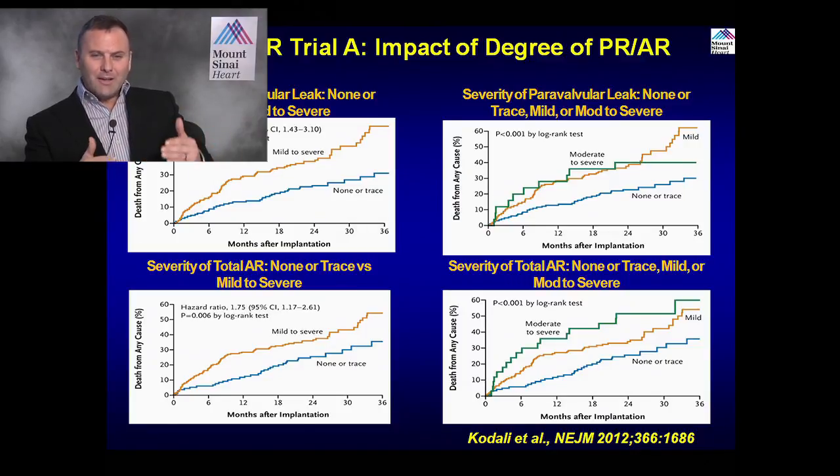And if the mild is underestimated and the mild is really moderate, well, then we are imposing a little bit of a load on a ventricle that's normally not seen any AI. And I suspect that in the original trials, perhaps they're underestimating the amount of regurgitation there was.